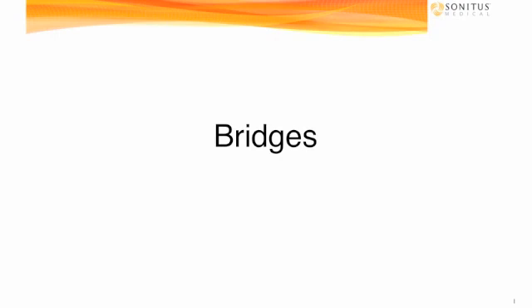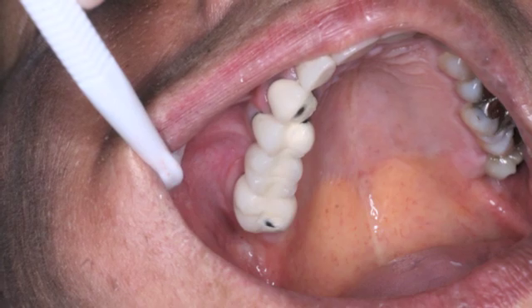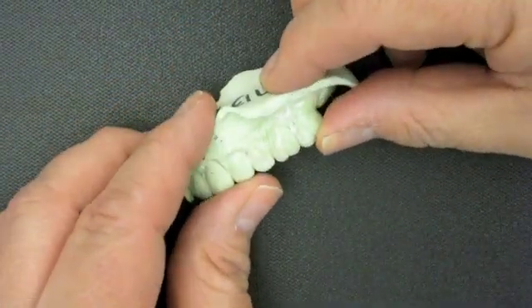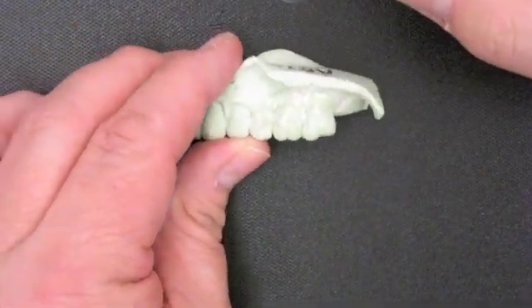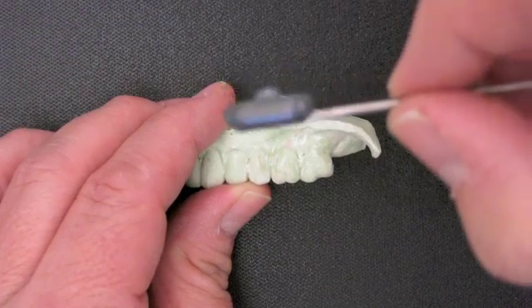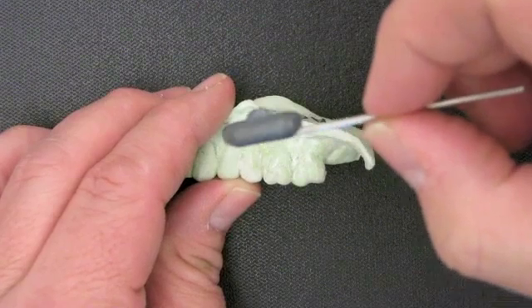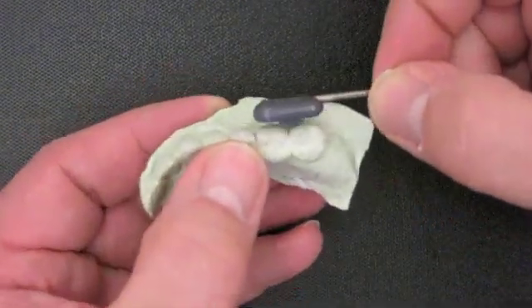Now let's talk about bridges for a moment. Bridges offer a number of challenges for a SoundBite, especially if we're trying to place the actuator on the pontic. Pontics have been shown to be a little bit challenging. Here's a 4-unit bridge, and I'm going to put the actuator up against that. And the problem is occasionally the actuator will slide up under the pontic, and thus not imparting the sound directly into the teeth, but actually imparting it into the gingiva.